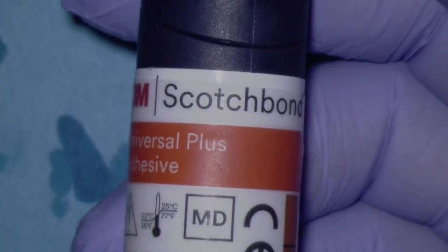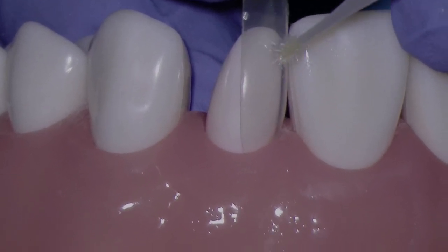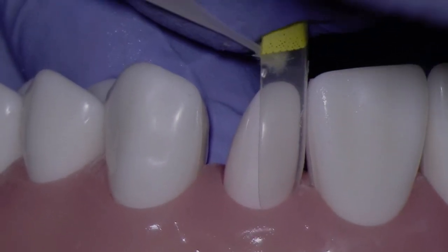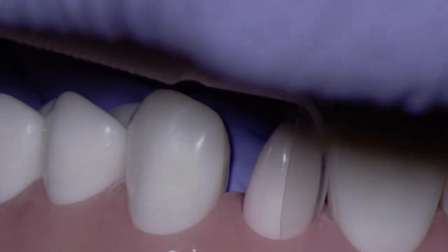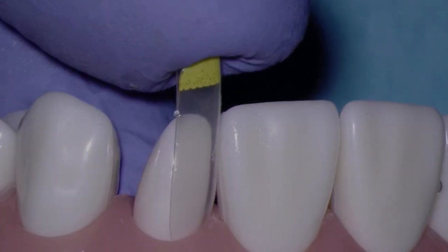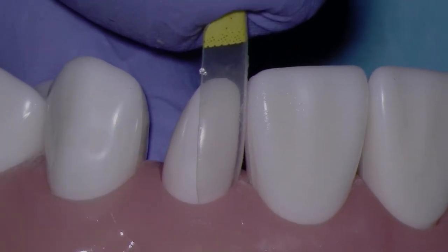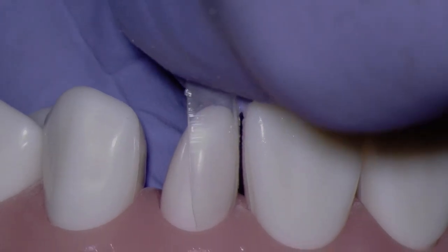Now I'm going to come in with the adhesive. I'm going to continue to hold the matrix in place to create a barrier. I'm going to put just a bit of Scotch Bond Universal Plus on the enamel. There's no need to massage it, just get it wet. Remember, use a very small amount of adhesive. And then we'll go ahead and air thin. We're going to continue to use the matrix as a simple barrier.